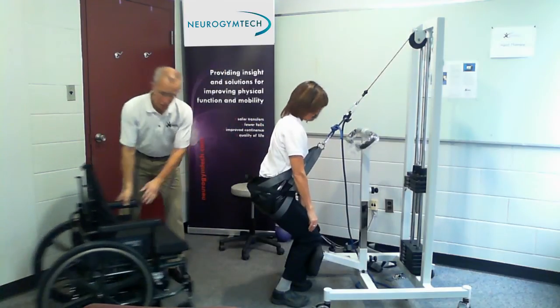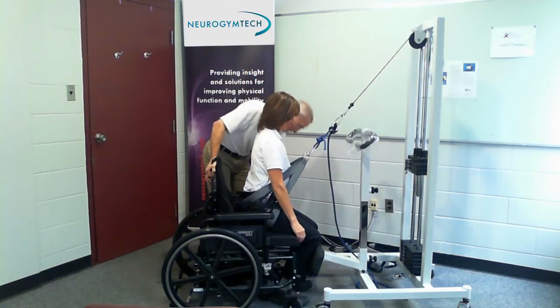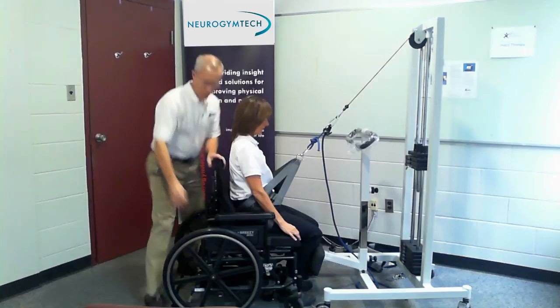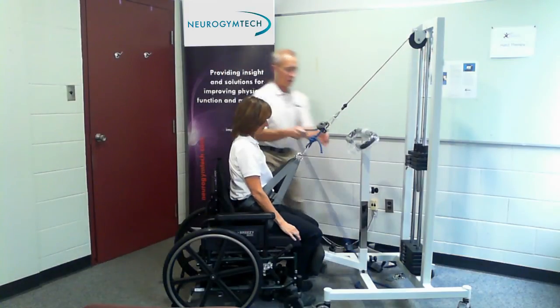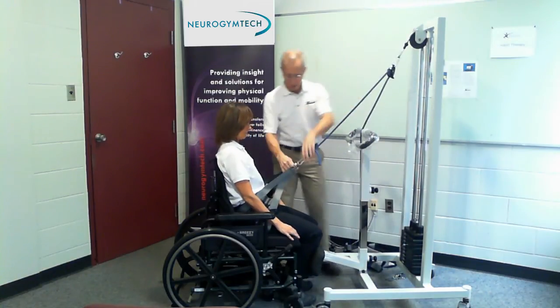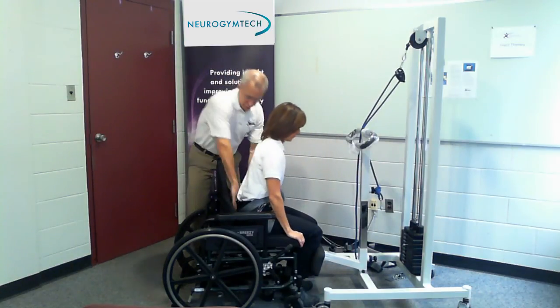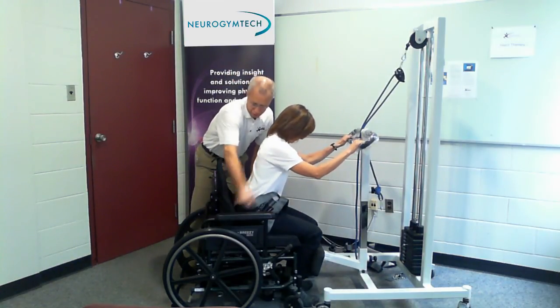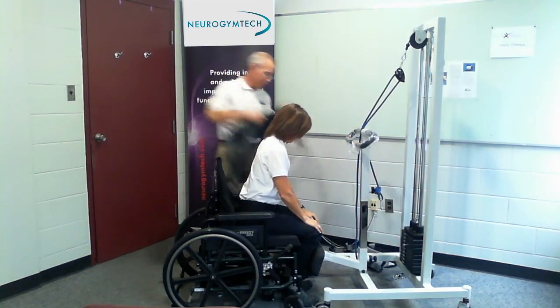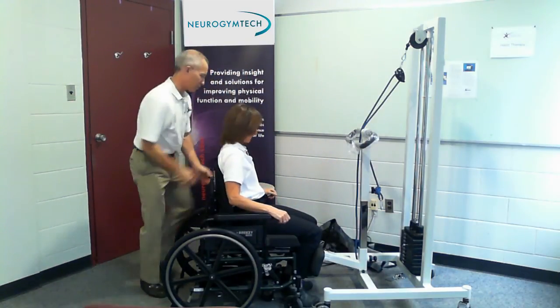One of the key things to remember is always bring the wheelchair back before you ask the patient to sit. Just lean forward a bit and we're going to take out the sling. Then we can take the patient back to their room because they're finished training for the day.